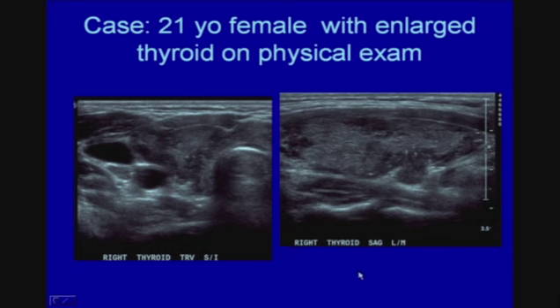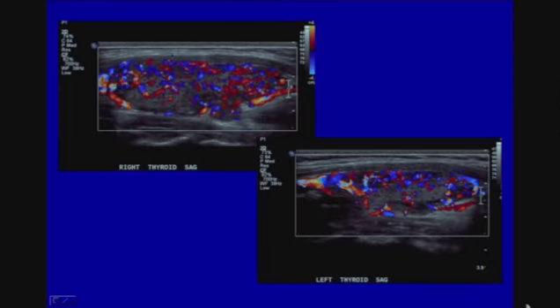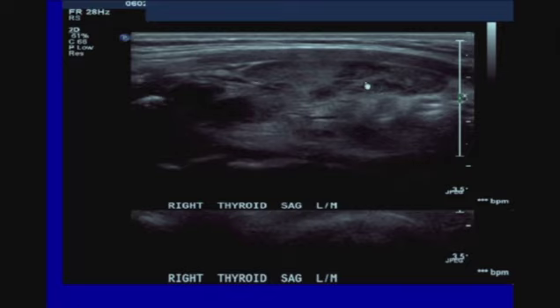Now, I want to show you this particular case. This patient was carried with the diagnosis of chronic lymphocytic thyroiditis, and she came to us. This is what her right lobe looked like here. Very, very patchy, hypoechoic areas. But again, notice these little tiny calcifications in the right lobe. This was her left lobe. Very similar appearance with some sort of irregular areas, some sort of normal areas. Vascularity, increased vascularity throughout the gland, no mass effect, again a finding we can see in the setting of chronic lymphocytic thyroiditis. And here's a video clip of what the right lobe looked like.